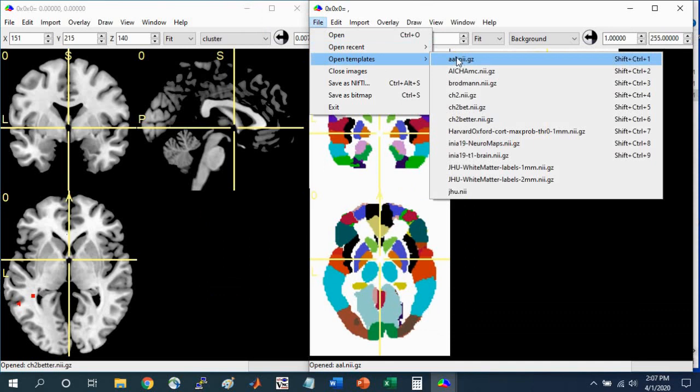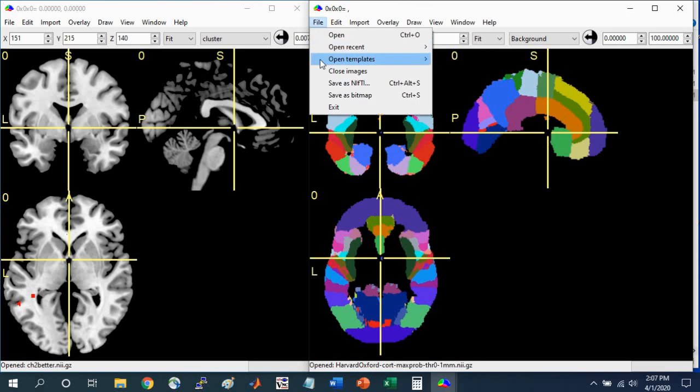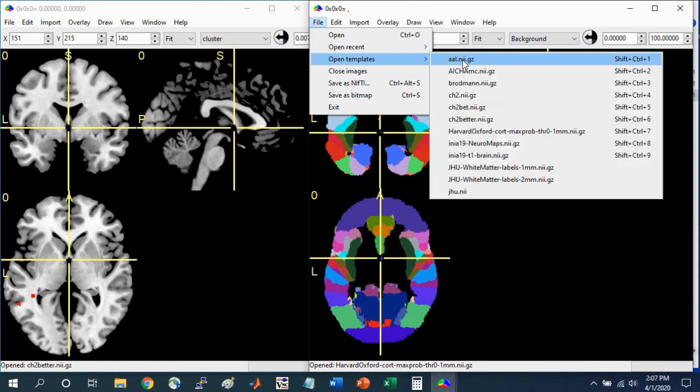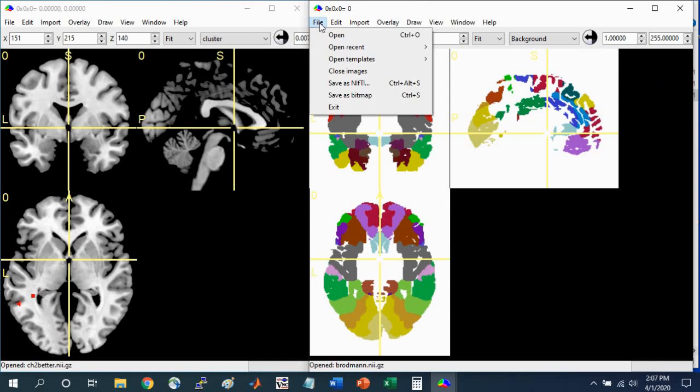Other atlases that might be useful are the Harvard-Oxford Atlas. This also comes with MRI-Cron. You can select that. And there's also the Broadman's Area Atlas that comes with MRI-Cron. Those three are the most useful for determining which brain region is associated with a functional cluster that you're interested in.